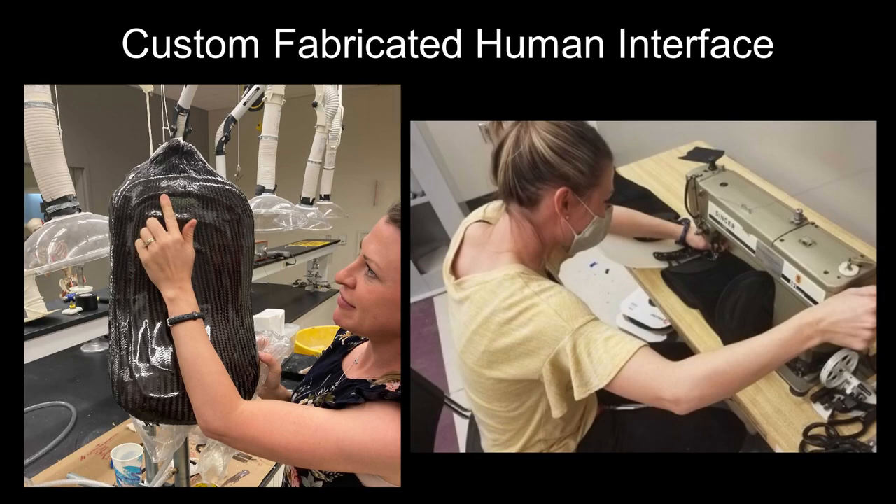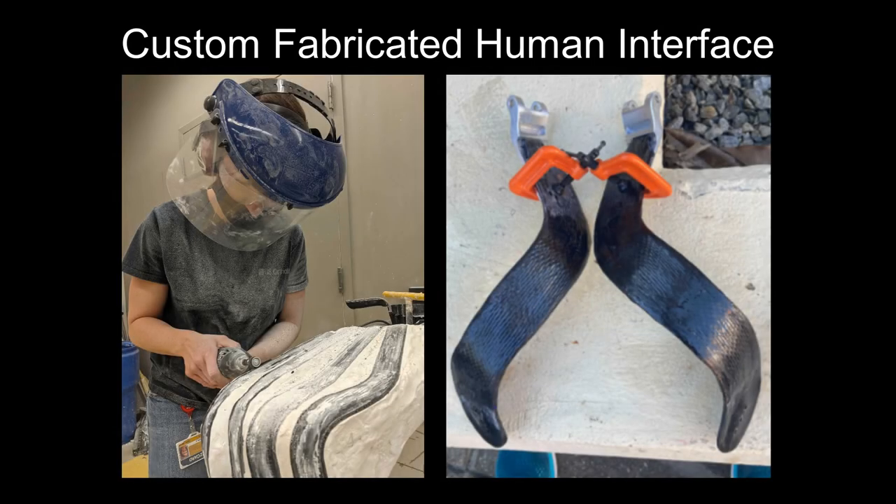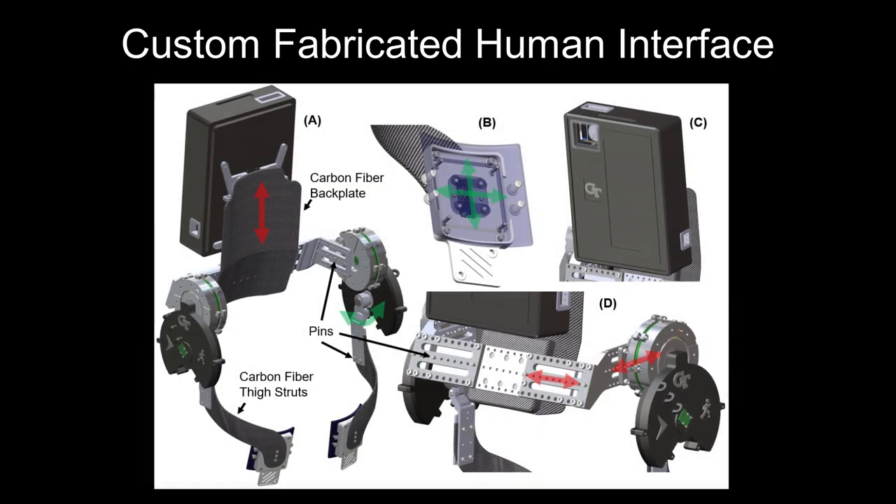To transmit high torques, a custom carbon fiber-based orthotic interface was developed with our clinical collaborator. The exoskeleton is designed to minimize distal mass, allow for passive movement, and adjust to varying body sizes.